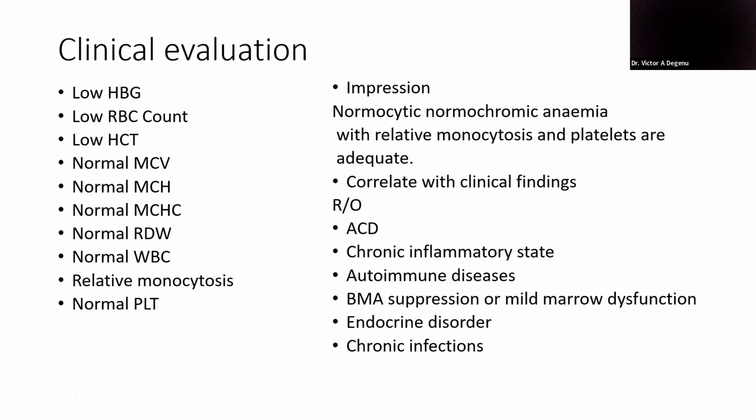In fact, the rule of thumb is that you don't always look at the percentage. You look at the absolute values as well. When you are interpreting your result, it is holistic to look at all the parameters, both absolute and percentage, in coming out with your decision. Thank you very much.